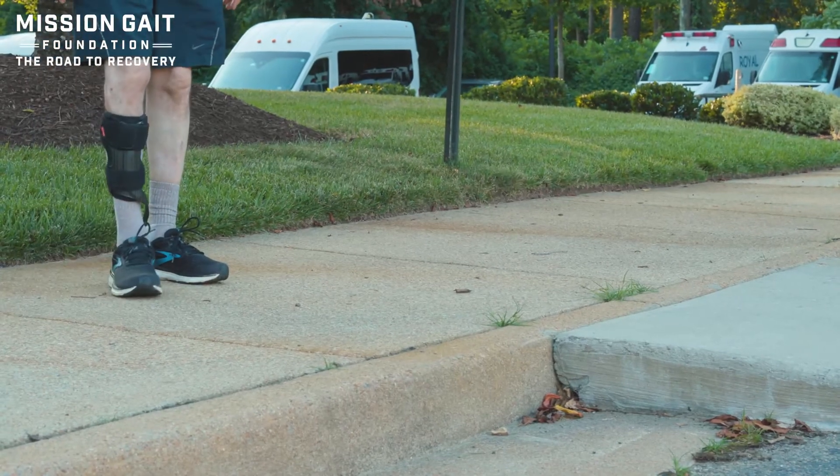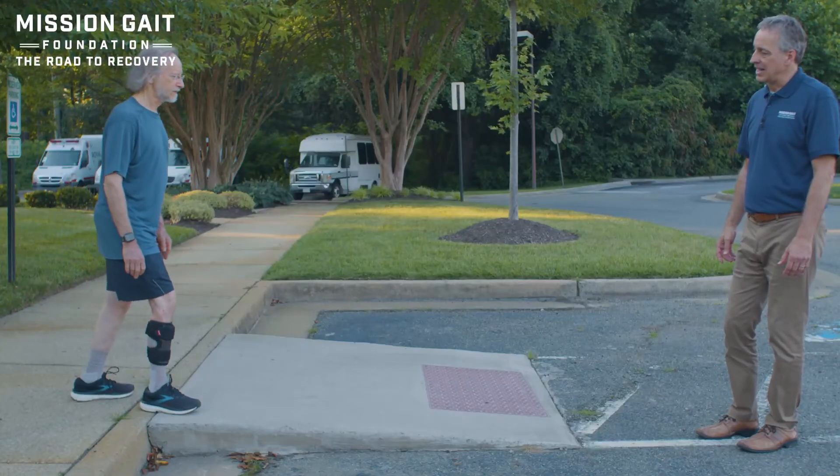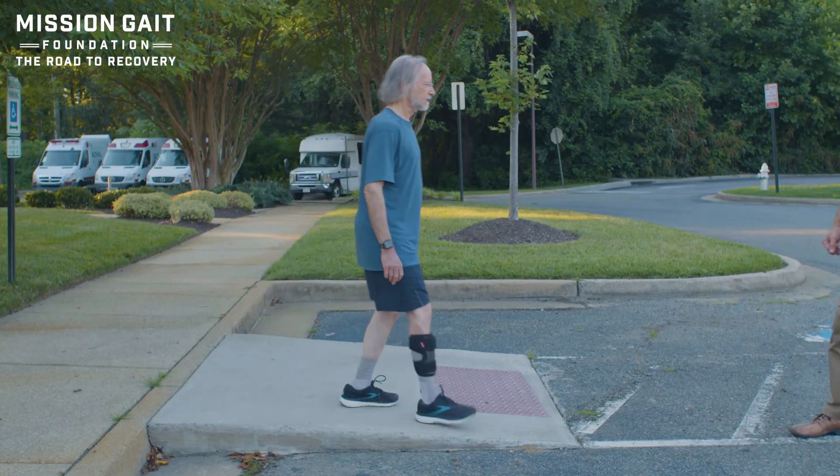Now when coming down, the opposite is important — that leg is going to want to get away. So bend that knee a little bit, feel the control, and then walk right through it if you feel strong enough.